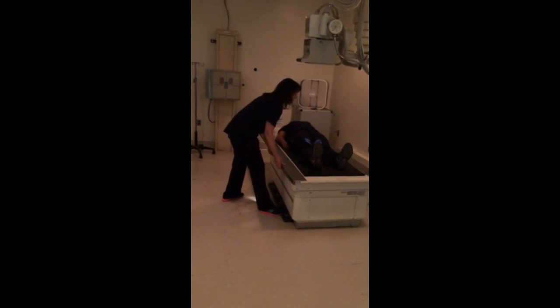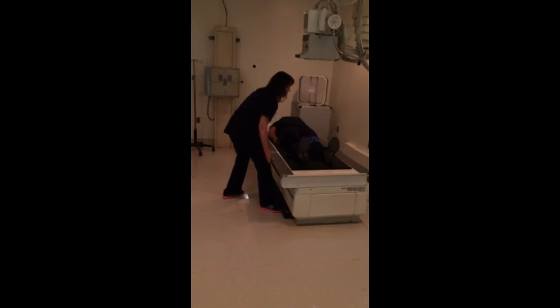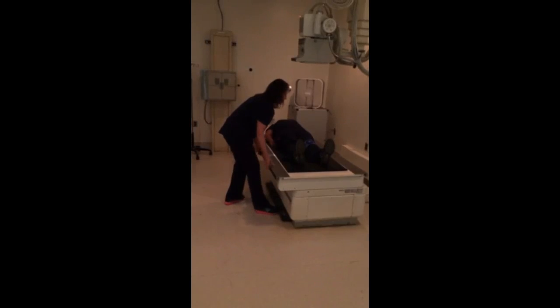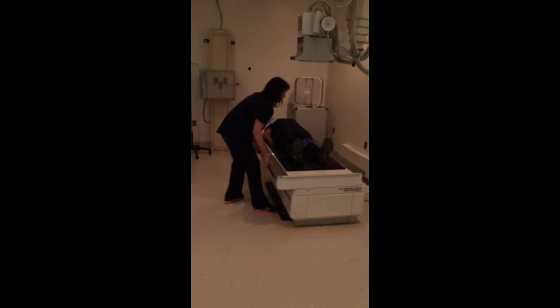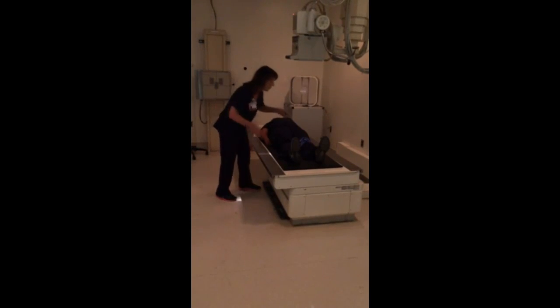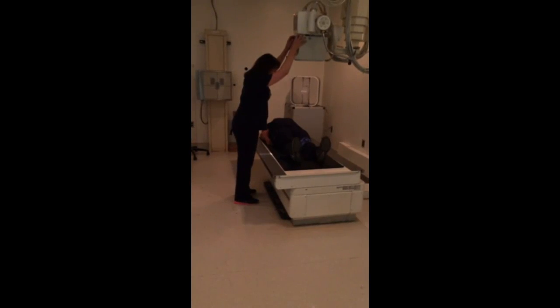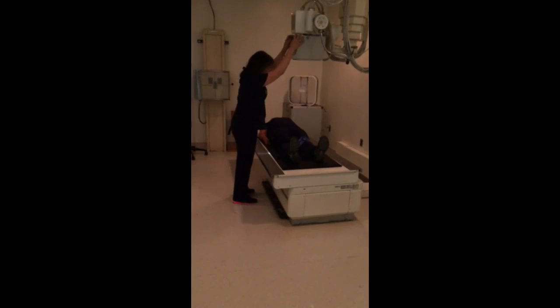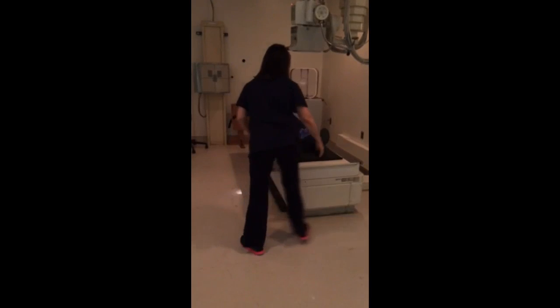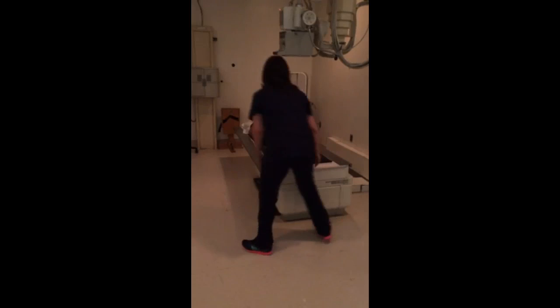My central ray is entering a half inch inferior to the patellar apex. The marker will go on the lateral side. I'll open up my collimator a little bit. Making sure that my leg has no rotation. Will you flex your foot for me a little bit? Okay. Thank you.